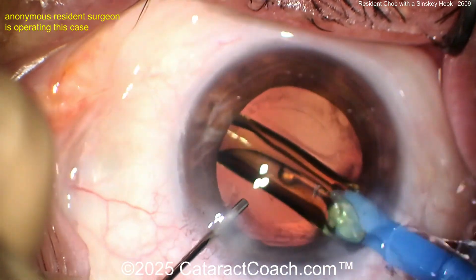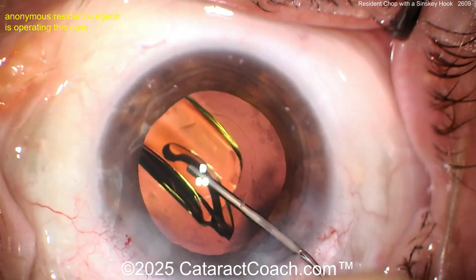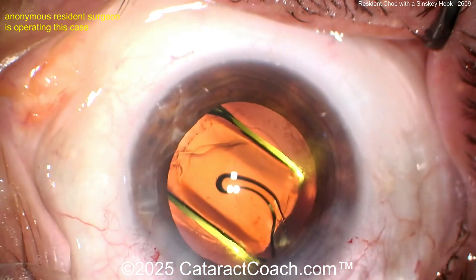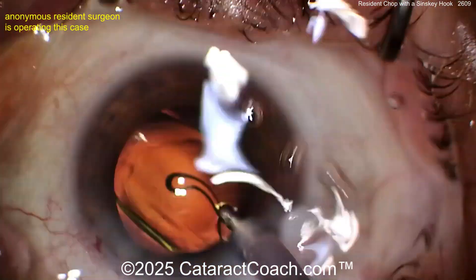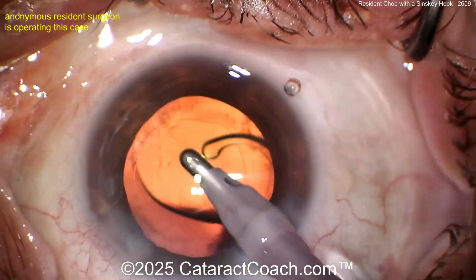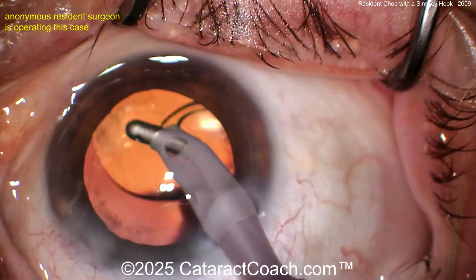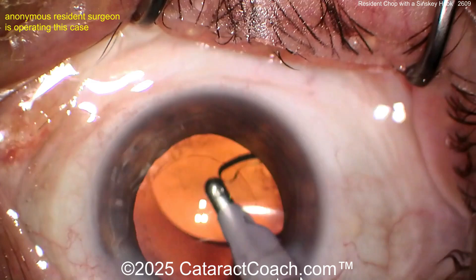Here comes the lens going in — capsular bag, single-piece acrylic lens. Get that delivered in there. Beautiful. Beautifully done. Beautiful rhexis overlap on the optic — 360 degrees. Get that last haptic opened up and finish the case. You could easily elevate your game by just doing a better job at draping.